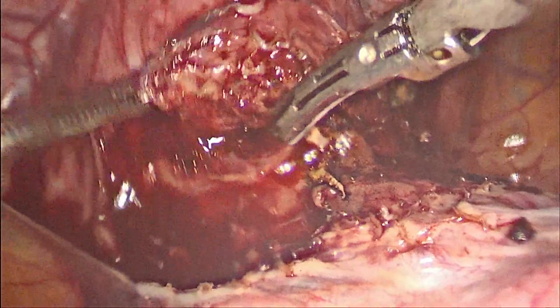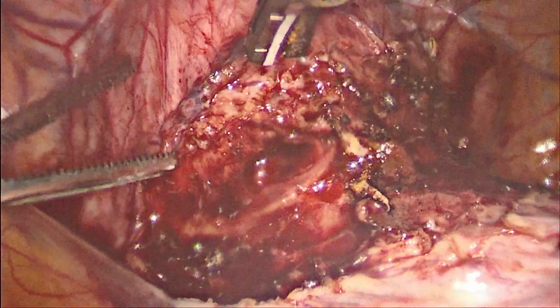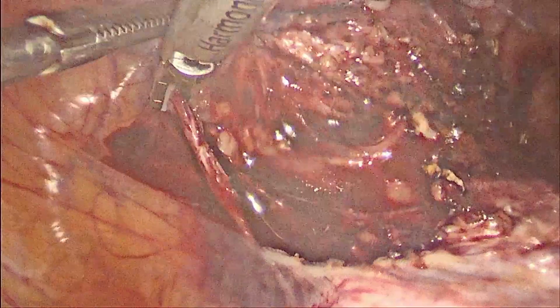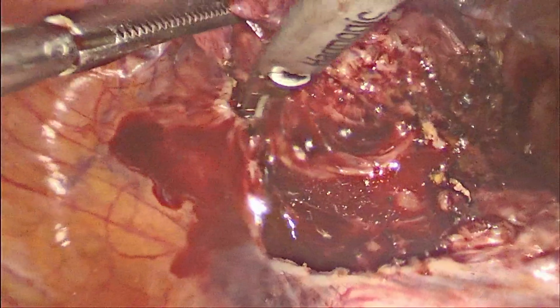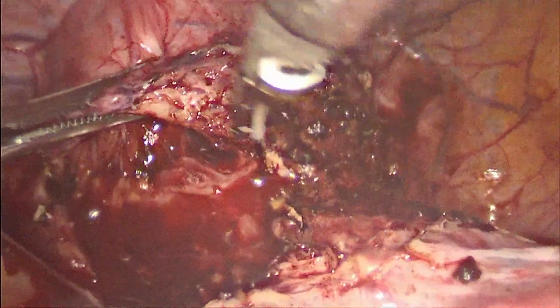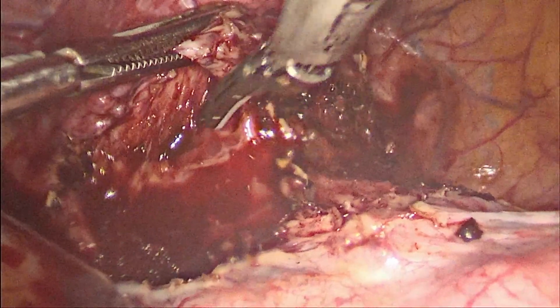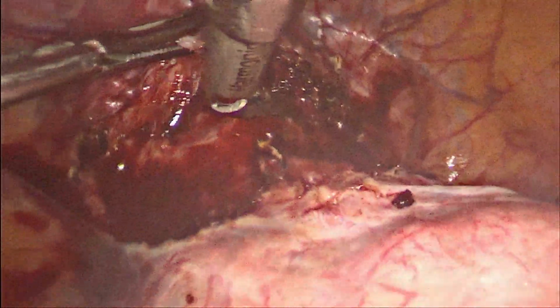We can see that even with this delicate dissection, there is staining of the area with blood, as there is a very high level of vascularity due to the anastomotic vessels of pregnancy and also chorionic tissue which is invading deeper into the very few cervical fibers of the lower segment.